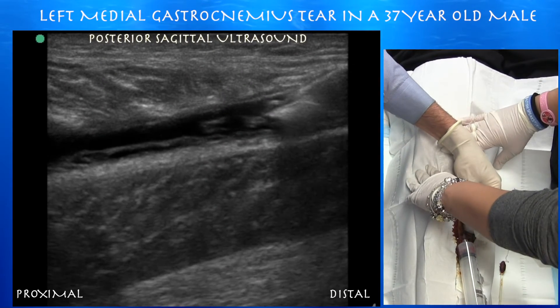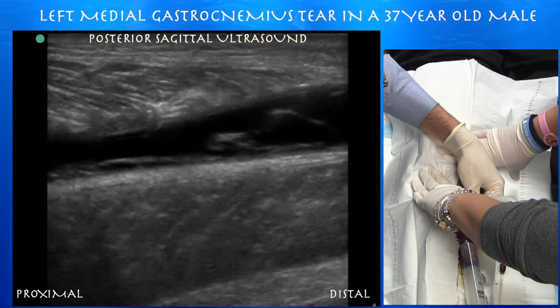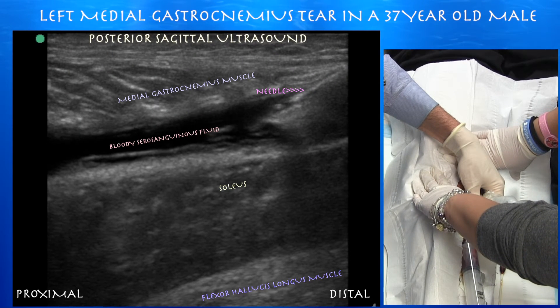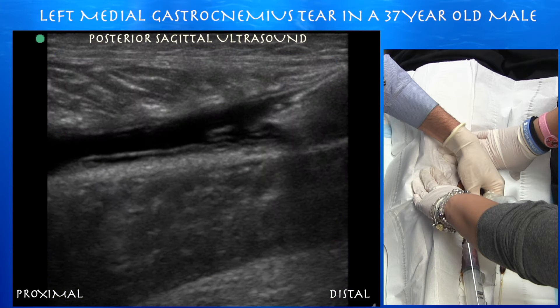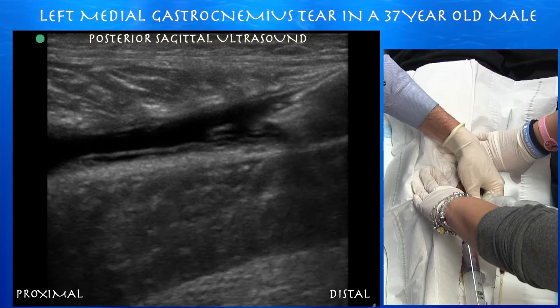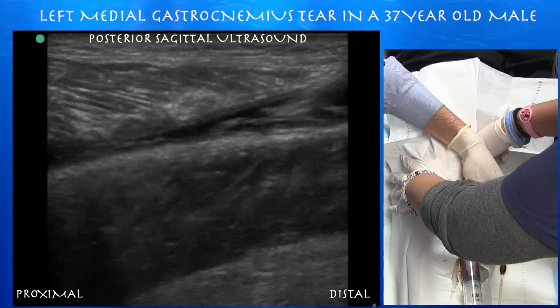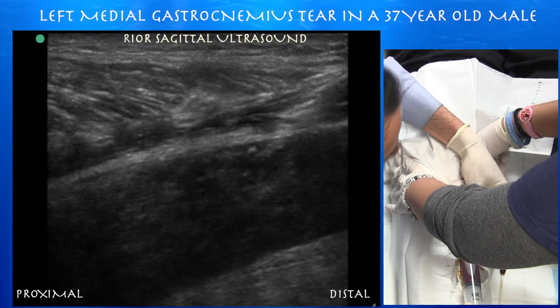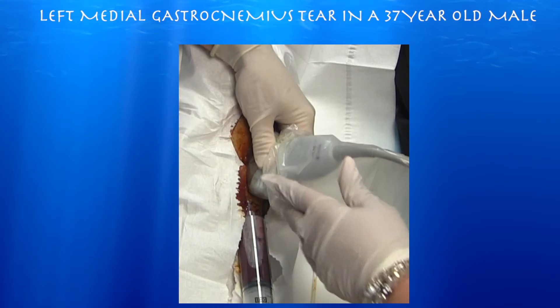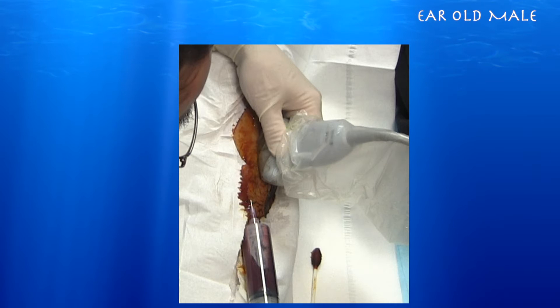We decided to drain it since there was a lot of fluid, using a 16-gauge, one-inch needle. We're avoiding the fibers of the distal medial gastrocnemius muscle, going in right where that muscle ends — through subcutaneous tissue and fat, right into the hematoma. Someone is applying gentle pressure proximally to extend the space and help drain what we can, and we're also using gravity with the leg on a slight decline.